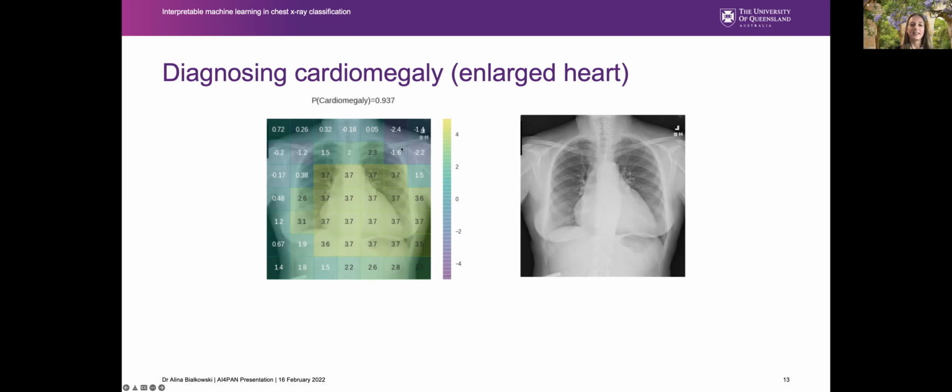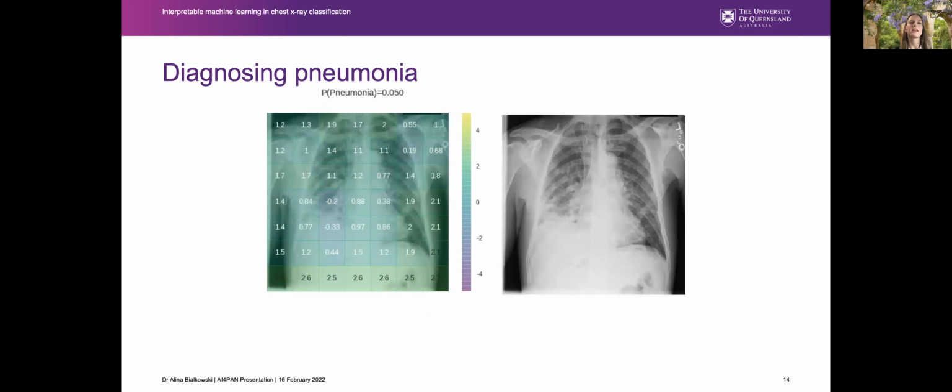And so we can see again that the convolutional neural network is not just using the heart to make its decisions. Other examples include these weird high weightings on the edges of images, and it's been suggested that perhaps that's detecting the scanner that was used. In different hospitals, there might be some kind of information, invisible to our eyes at least, that the neural network is using to make its prediction. So it's learning the association to the scanner that it was taken on and not the actual disease. This can result in missing the findings because of looking at the wrong information.